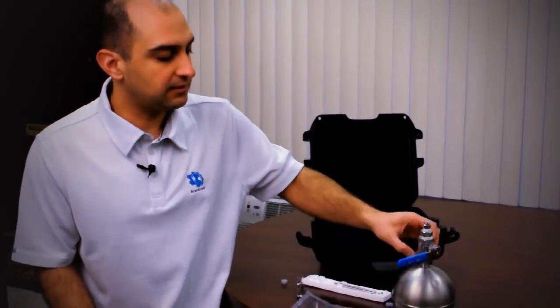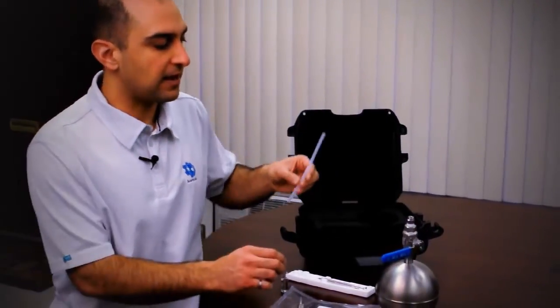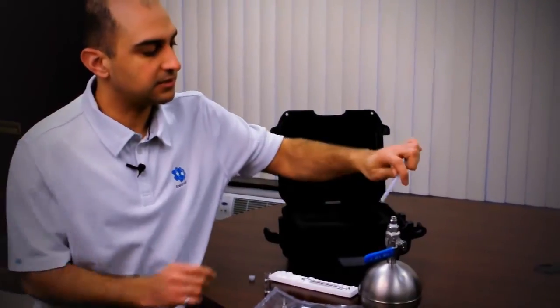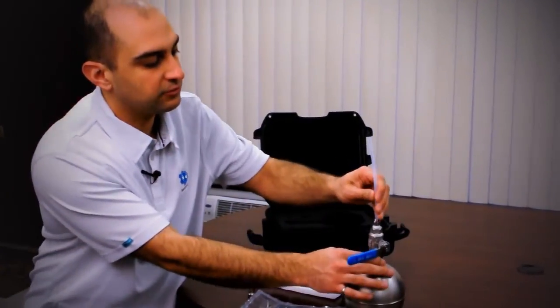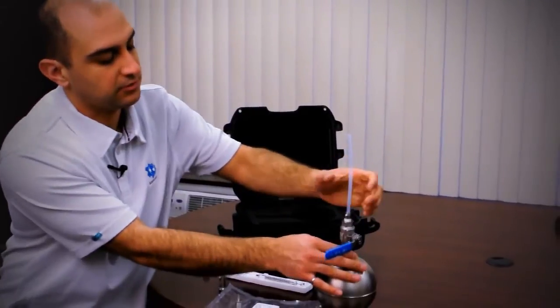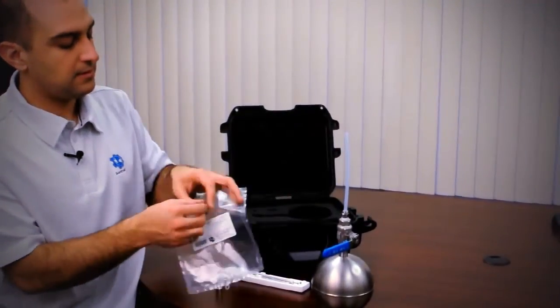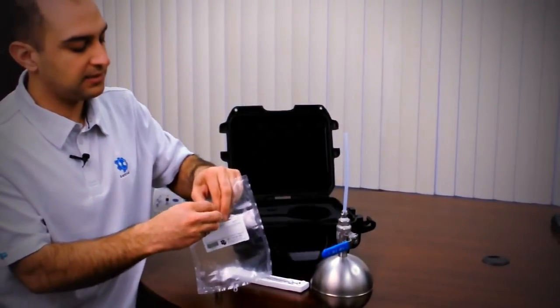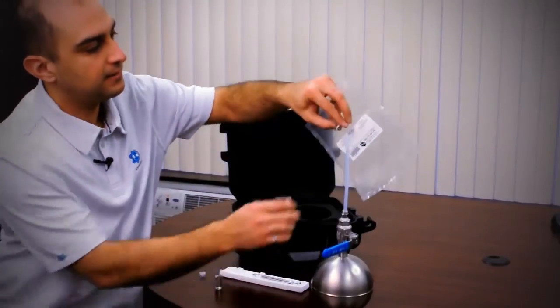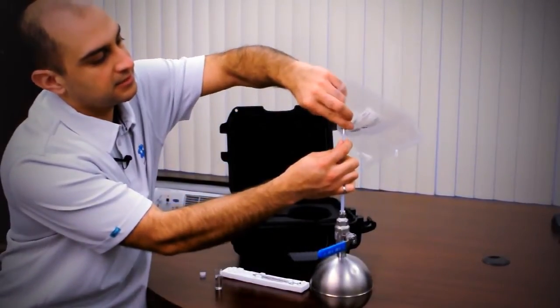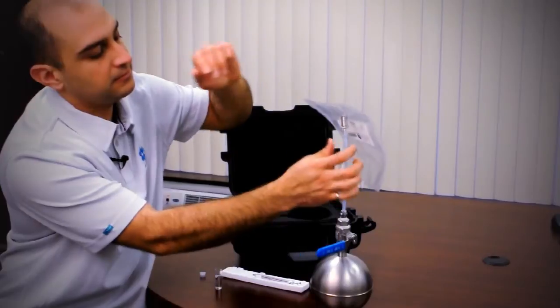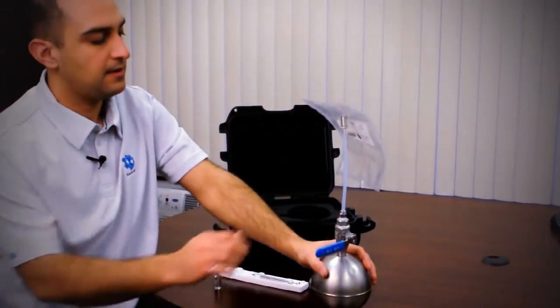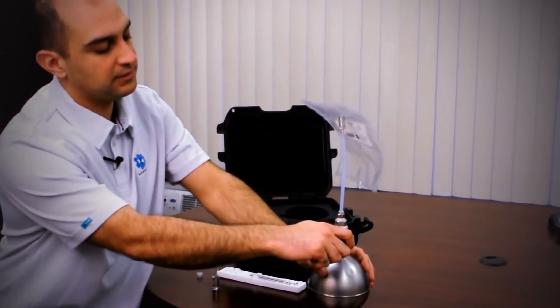Once that's completed, we are ready to fill the Tedlar bag. We insert the Teflon tube into the canister and make sure it clicks. We then open the Tedlar bag, insert it into the Teflon line, and slowly open the valve.